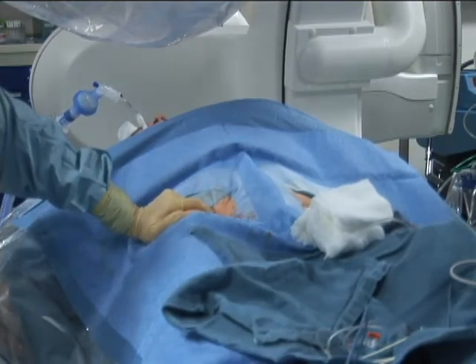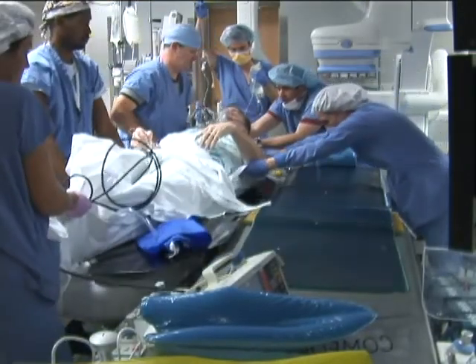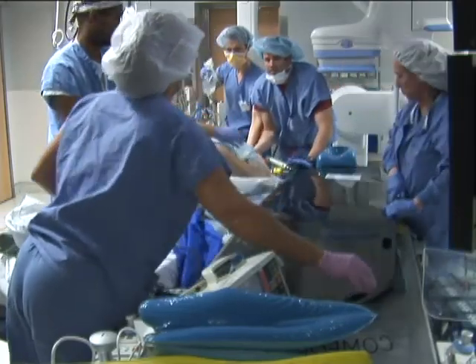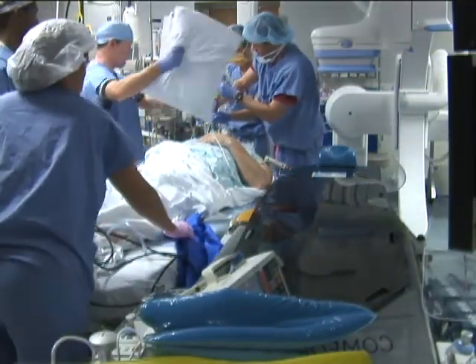All cables and drapes are removed from the patient. The patient is then transferred to a stretcher. It is important not to bend the legs for 4 to 6 hours after the procedure to prevent the development of hematoma. The procedure is then complete.